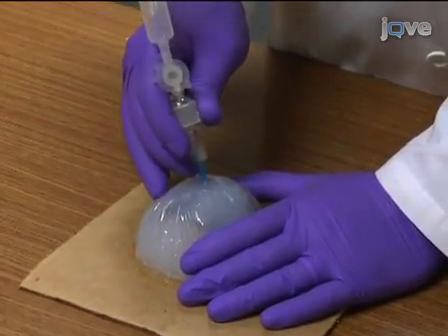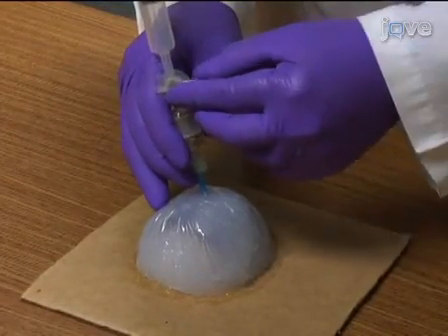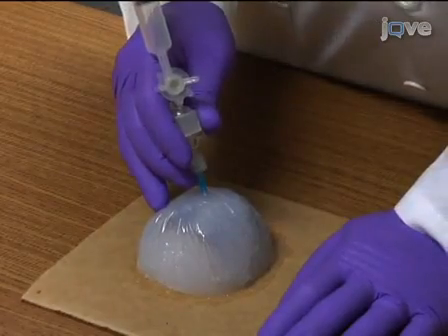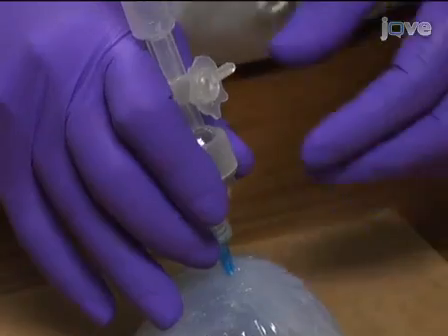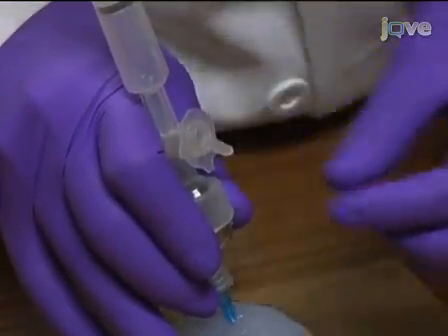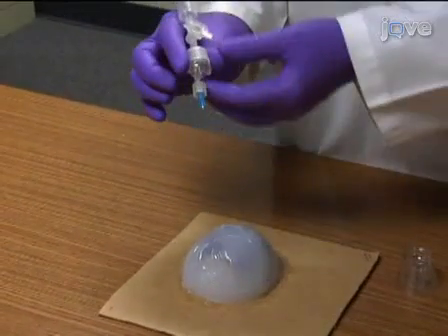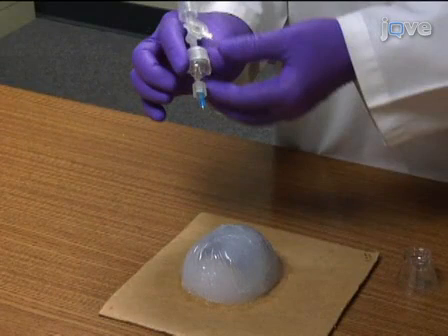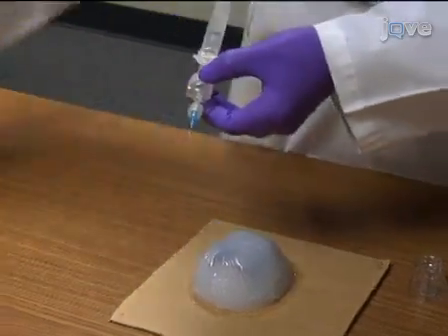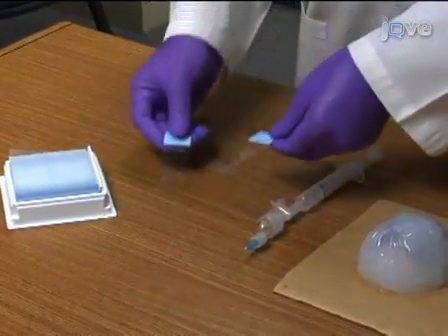When you are done sampling, rotate the valve to disconnect the vacuum in the syringe barrel and equalize the pressure with exterior conditions by opening the valve. Next, rotate the valve to disconnect from the exterior and the syringe barrel. Remove the needle from the lesion with the valve closed. Keeping the valve closed maintains slight negative pressure in the hub end and prevents the specimen from draining back into the lesion by capillary action, comparable to pipetting phenomenon. Your tissue sample is now safe in the needle hub.